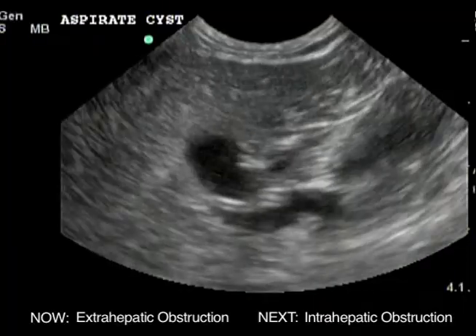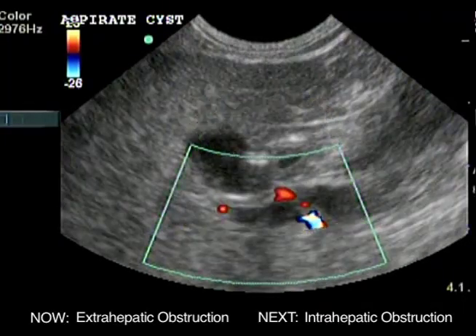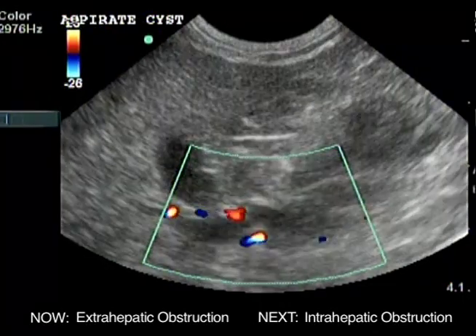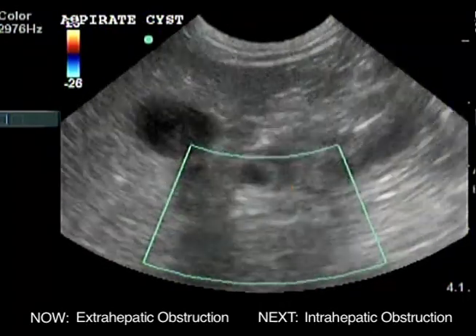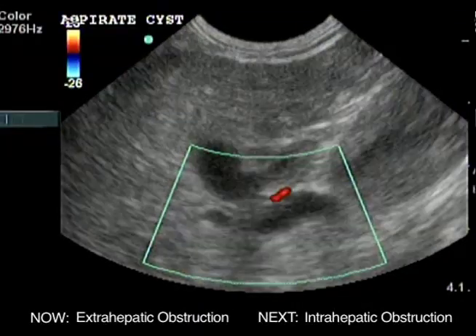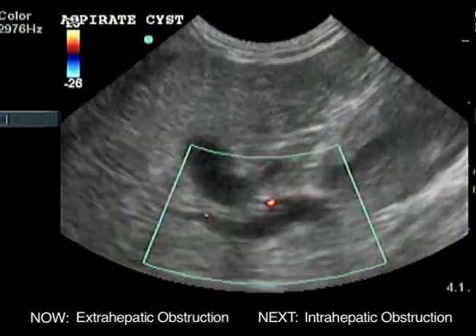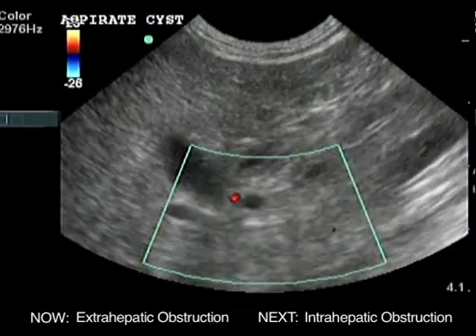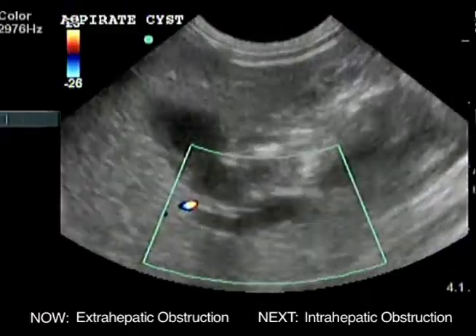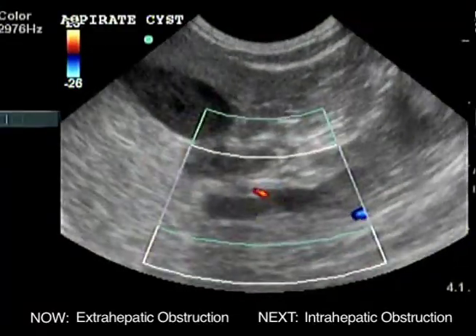This video from the same cat shows the enlarged common bile duct near the duodenum. The common bile duct does not show color with color flow Doppler. Intrahepatic bile ducts, too many tubes, are not seen around the cystic duct. In dogs and cats, the common bile duct will enlarge first. 5 to 7 days later, the intrahepatic bile ducts enlarge.